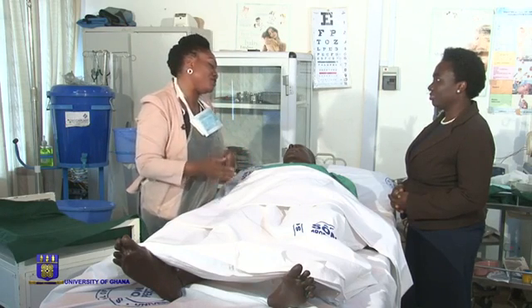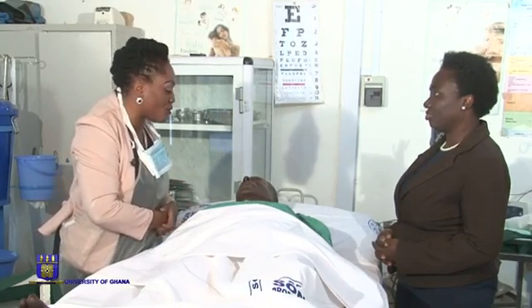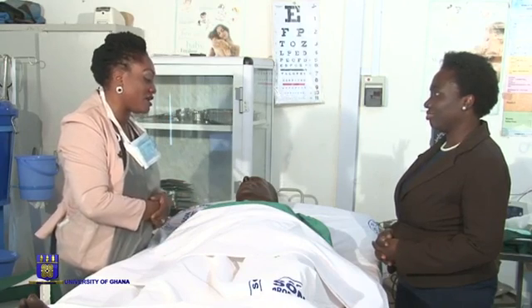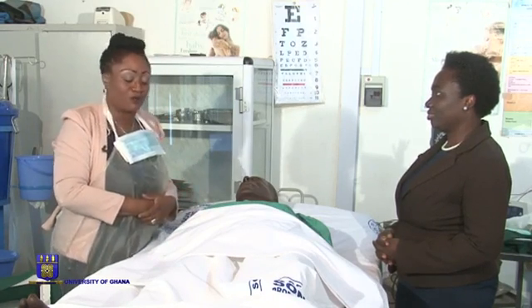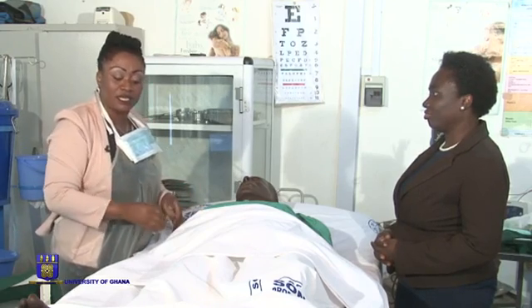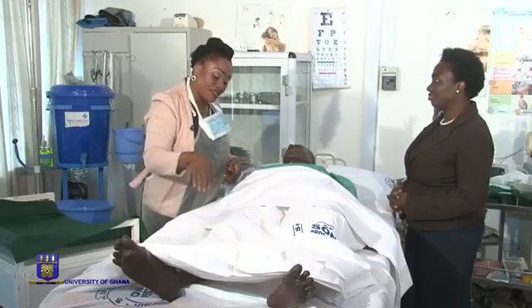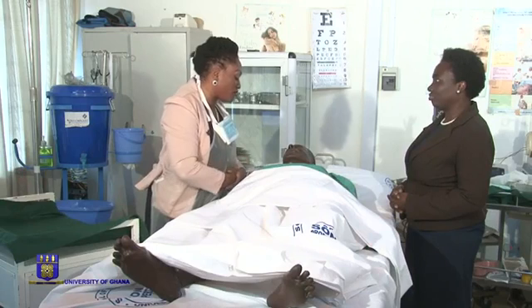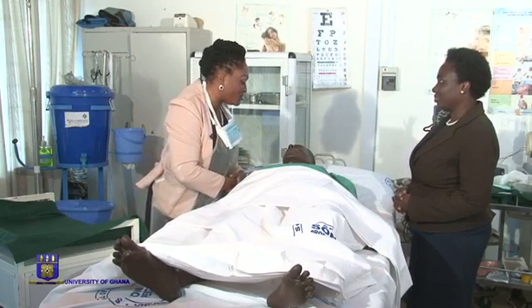The wound is being dressed to aid in early healing, so that you will recover quickly and go home early. My assistant is here to provide the necessary assistance. She is going to position the hand for me, and also expose the sides by removing your cloth and the bed clothing. I hope you are going to cooperate with us.